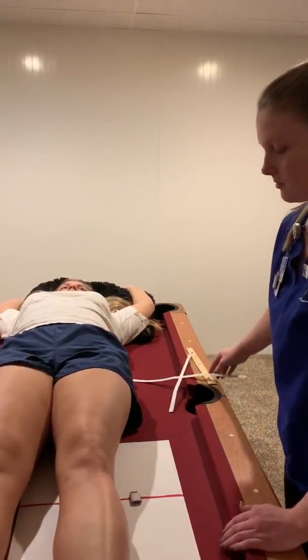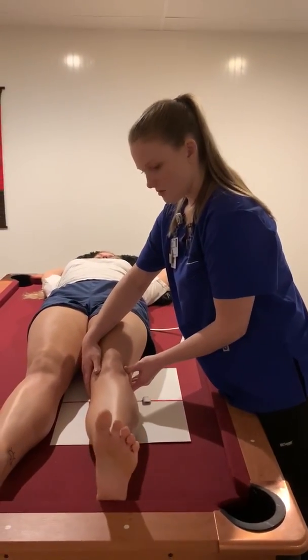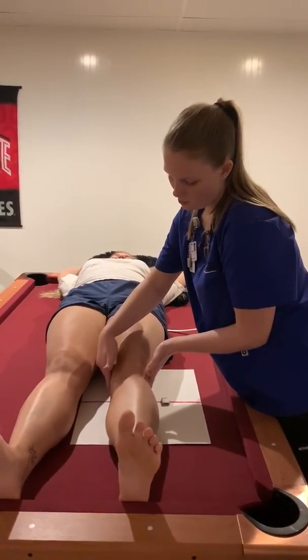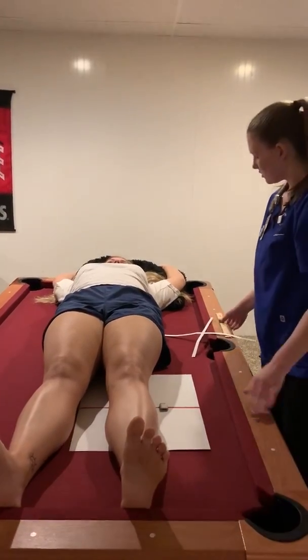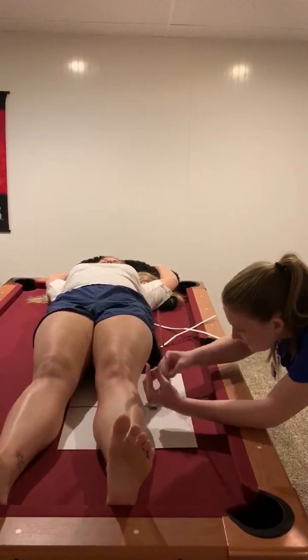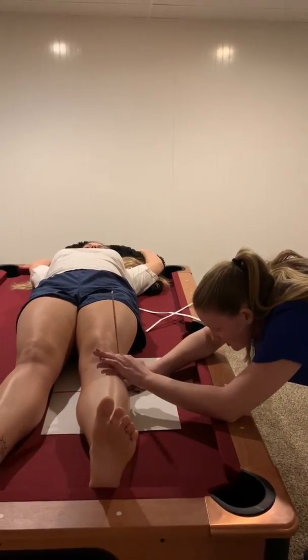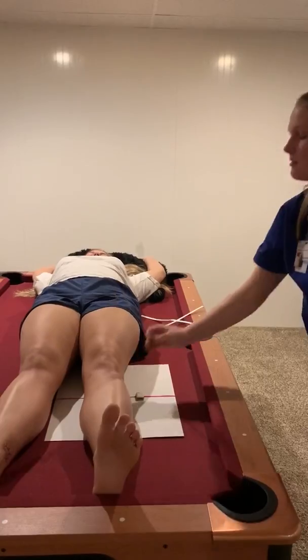And then I can also double check to make sure there's no rotation by making sure her foot's straight and checking that the epicondyles of the femur are both equidistant to the IR. And then I'll measure from where the central ray enters to where it exits. So from here to here, that would be about 13.